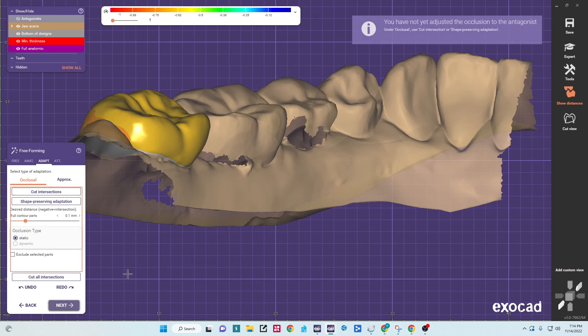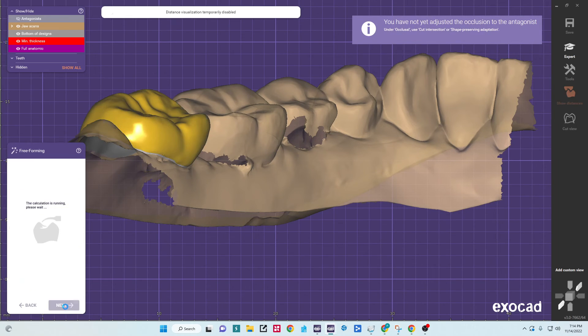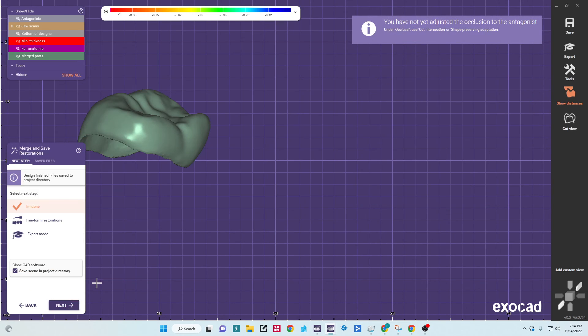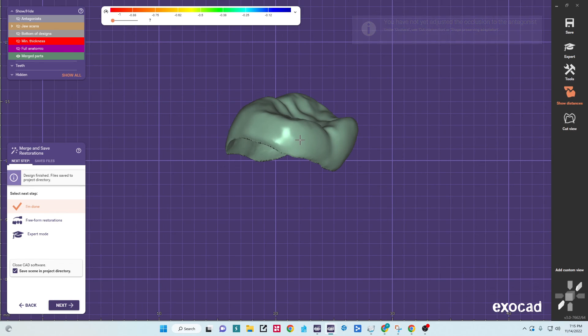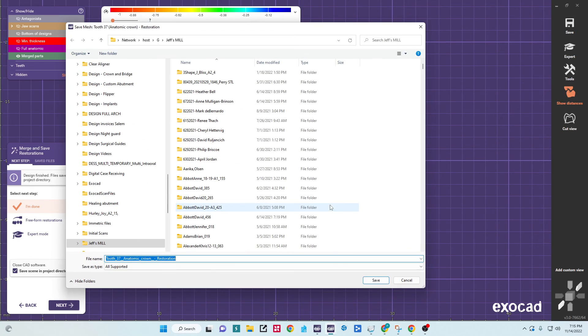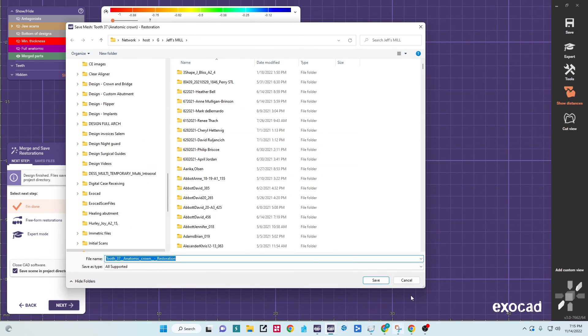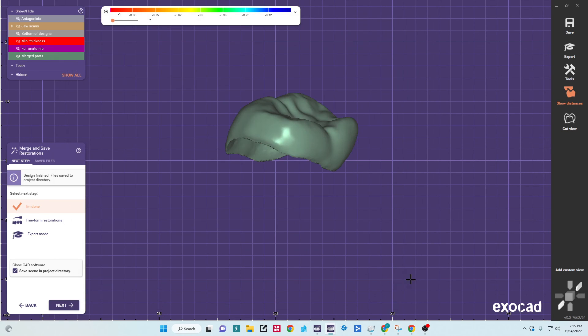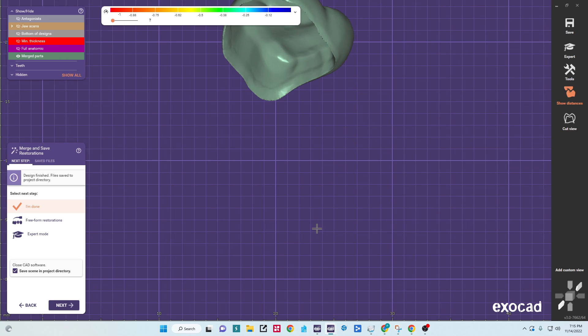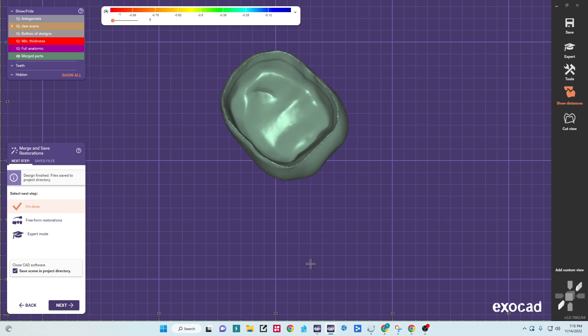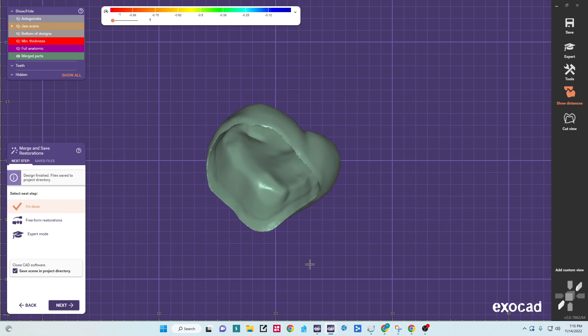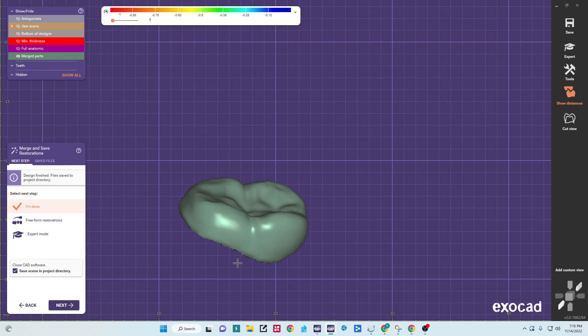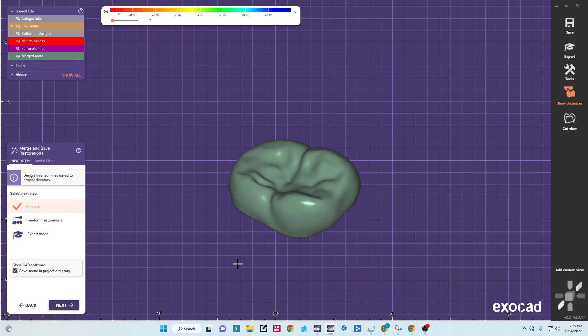And it will go ahead and merge the restoration. From here, we'll right-click, save to file, and we'll save it out as whatever we need to. From here, if a model needs to be created, you can click forward and move into the model creator.